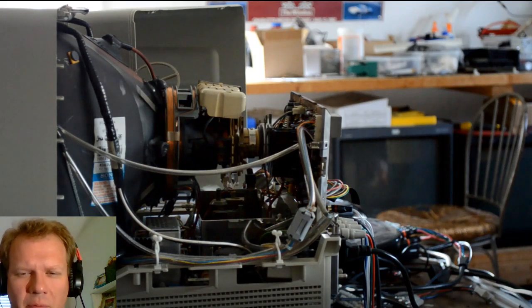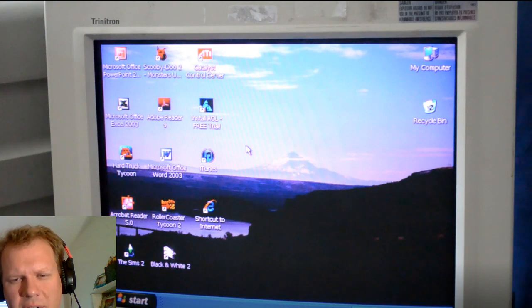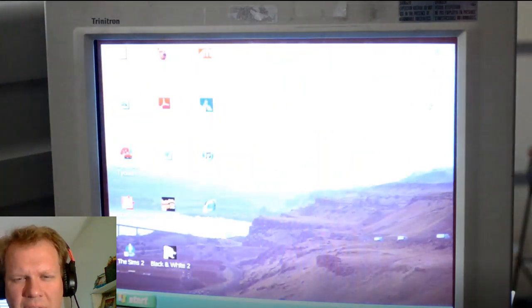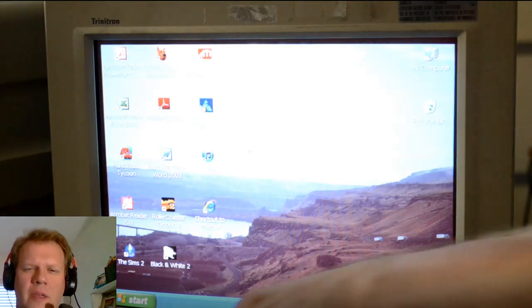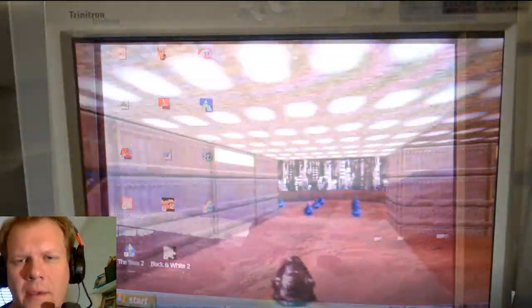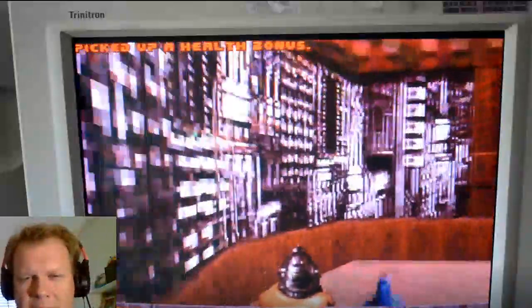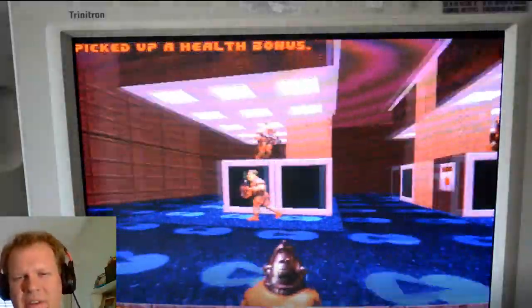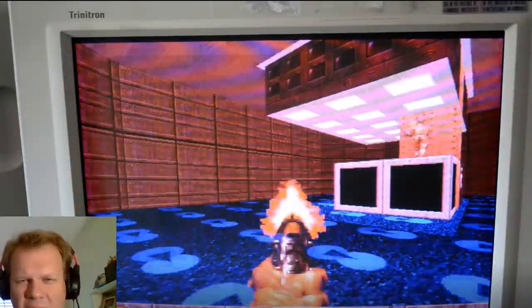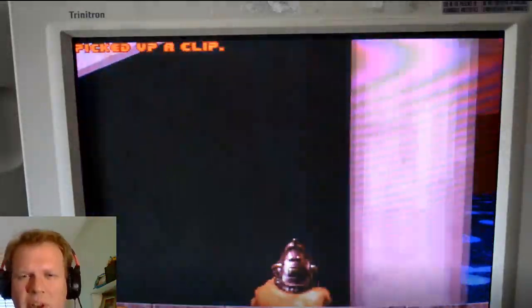So now that I've hooked everything back up, we're going to turn up some of the brightness again. And right away, I could tell that the colors came through. I think we were missing the red on this particular monitor. So right away, I just fired up some Doom, and this is just a demo of me playing through some Doom. But this monitor is very great for using it to play these retro video games.